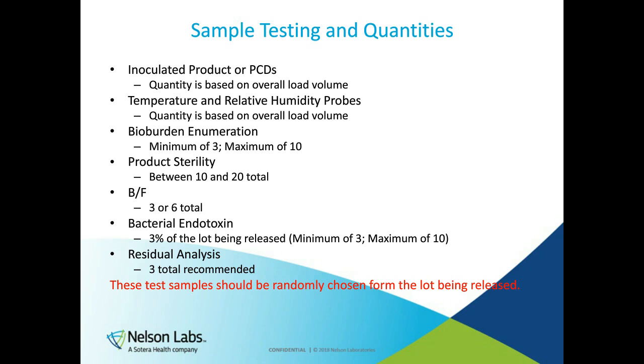And keep in mind that these products are randomly chosen from the load from the actual product lot. So predetermining sample quantities or samples to use for testing is usually frowned upon.